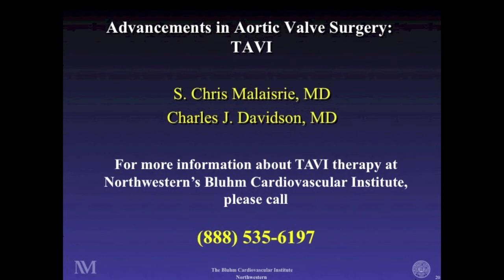Great. And so to clarify, I don't know if I heard it correctly, or you may have touched on it earlier in the conversation. Is TAVI applicable to both aortic stenosis and aortic regurgitation, or is it specifically for aortic stenosis? So right now it is just aortic stenosis and non-bicuspid valves, which is how it's approved in the United States. Many of these new technologies are specifically geared toward being able to also treat aortic regurgitation.